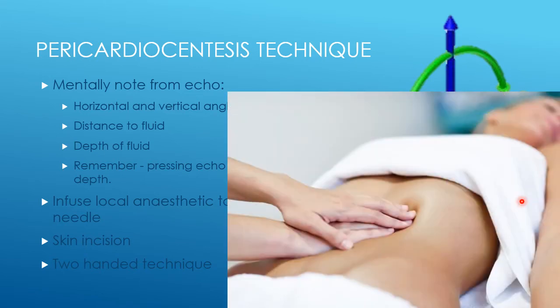So if, for example, you're palpating the abdomen, imagine it's not quite the same position. Unfortunately, I couldn't find a perfect photographic match for pericardiocentesis, but you can imagine that if you were trying to insert a needle here, the act of pressing into the abdomen will very much affect the actual angle that your needle can take and the need to go underneath the costal margin. So think in terms of the difference in position and angle when you're pressing on the abdomen as opposed to when you're resting a needle gently on the surface.